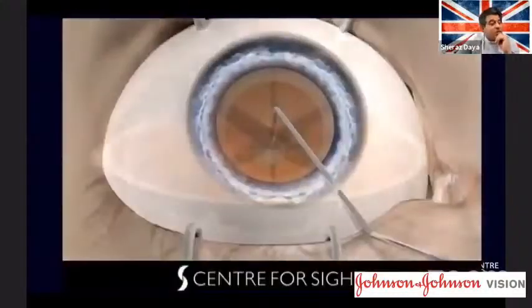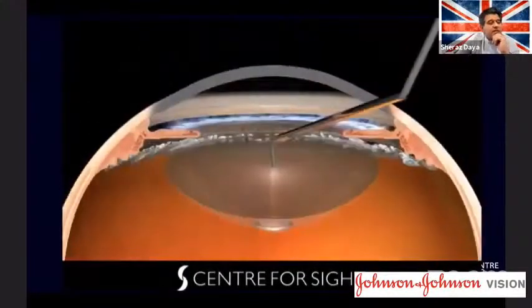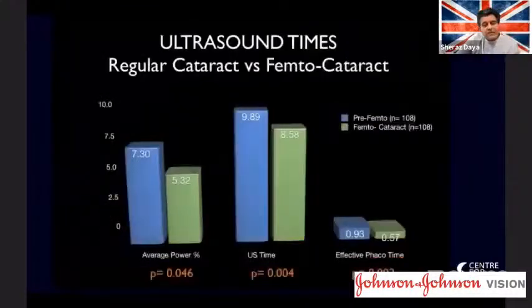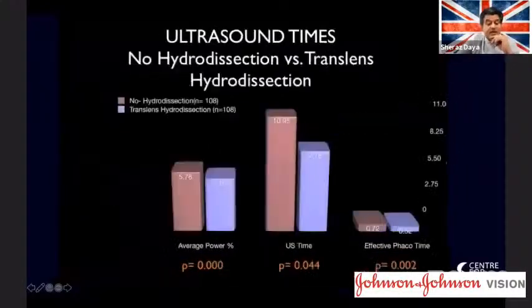So why do we manage to hydrodissect without distending the capsule? Well, that's because any excess fluid goes right out where the cannula is, and that avoids breakage. And we found that doing femto certainly reduced effective phaco time statistically significantly, and translens compared to without translens reduced it further. And this we published a while ago.